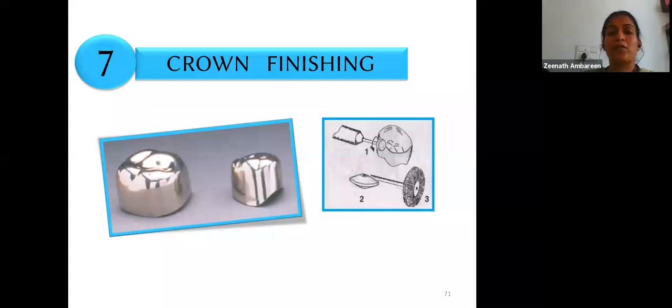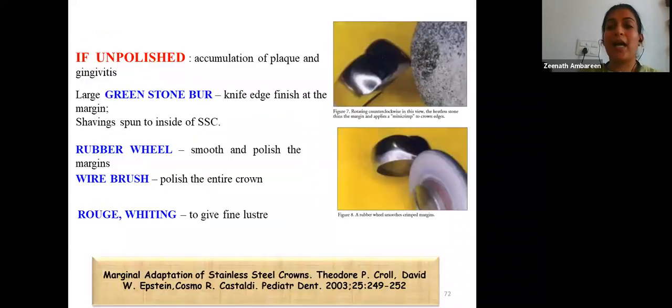Crown finishing involves smoothing and polishing all irregularities and sharp margins created during manipulation. Leaving the crown unpolished can lead to plaque accumulation and gingivitis. A green stone, rubber wheels, and wire brushes can be used, with rouge or whiting applied for a fine luster.